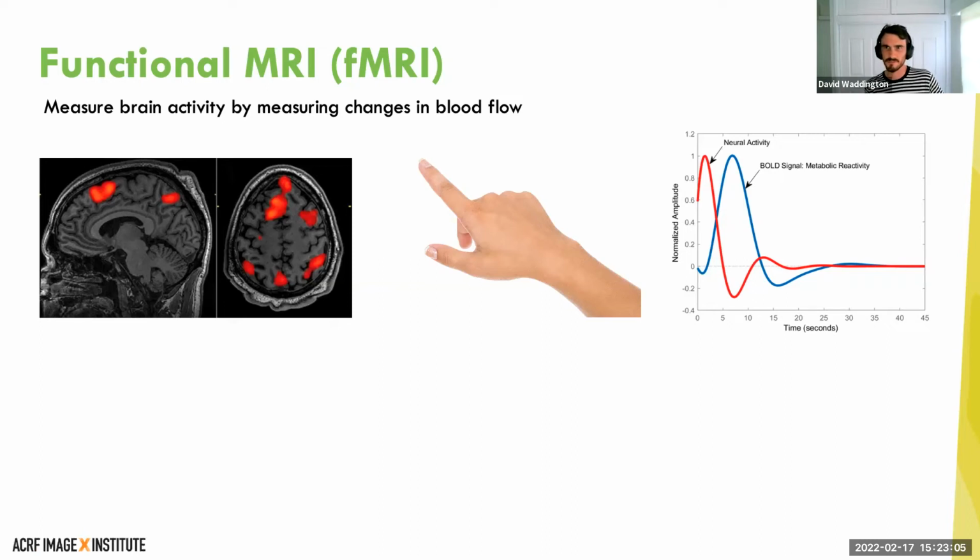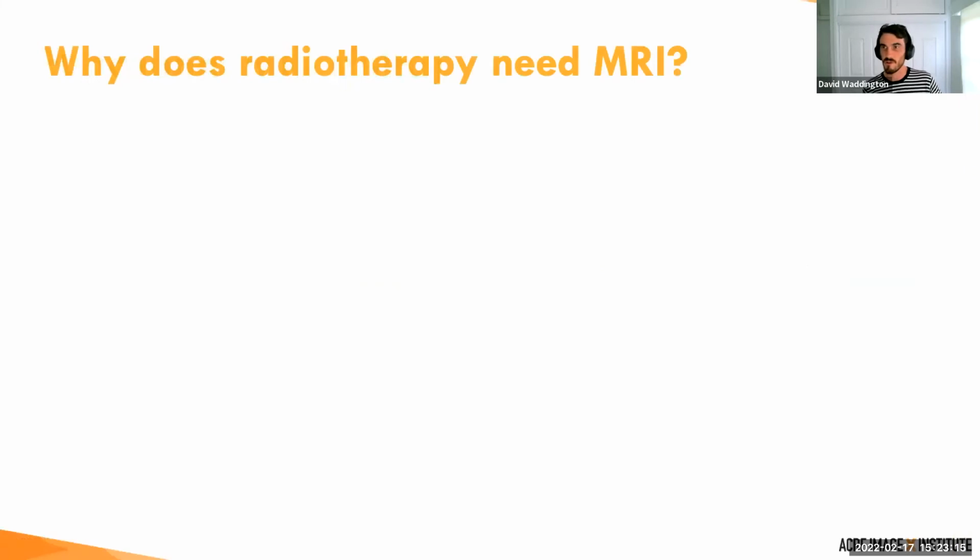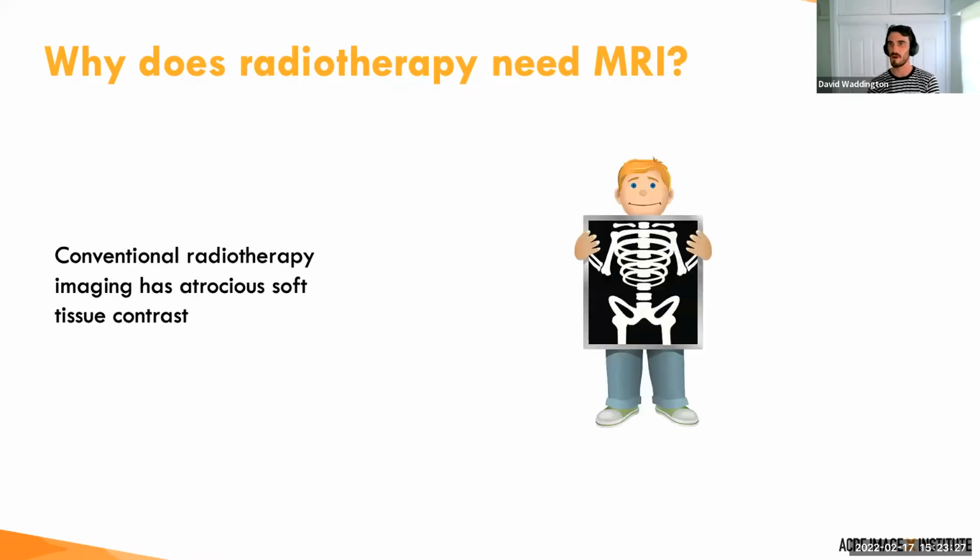Now, at ImageX, we're really focused most of our work around radiotherapy. And you have probably heard a lot up to this point about CT and X-ray based imaging modalities that have been used for ages in radiotherapy. So there's this question of why do we need MRI for radiotherapy? And that's because the conventional imaging techniques, X-ray and CT techniques, have terrible soft tissue contrast.